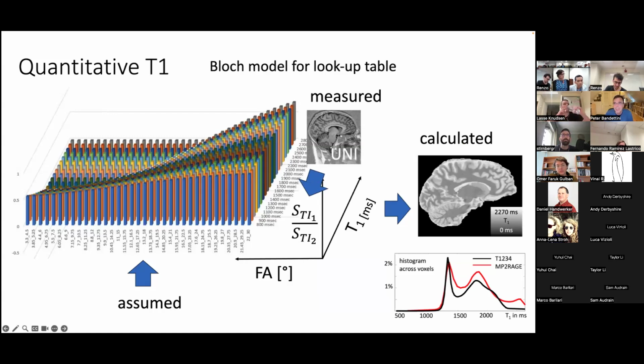So the big assumption is the flip angle over space, the flip angle versus T1. So the T1s, right, if you have different flip angles, it'll give you different T1 values because of the RF inhomogeneities. And if we could characterize those, then we don't have to make as many assumptions. But I don't know, you have limited time already.